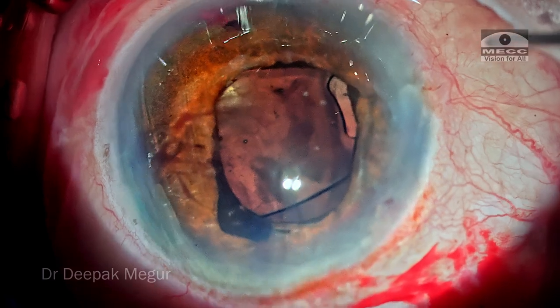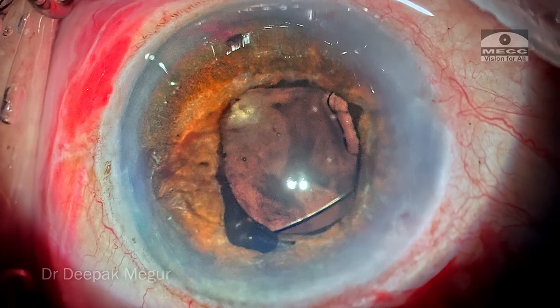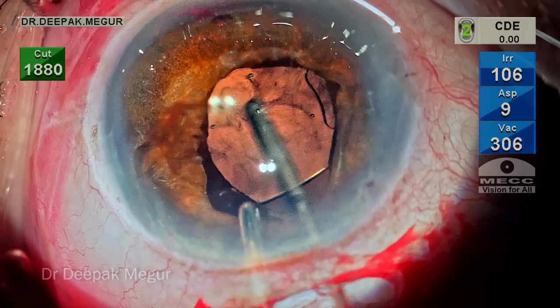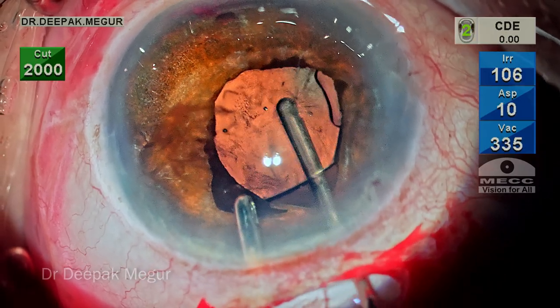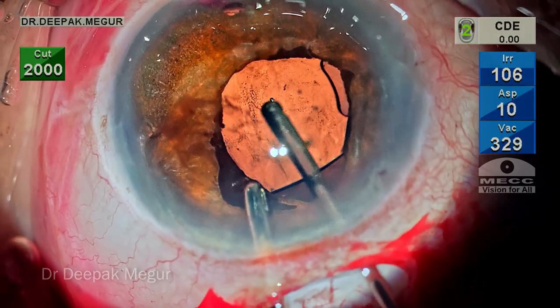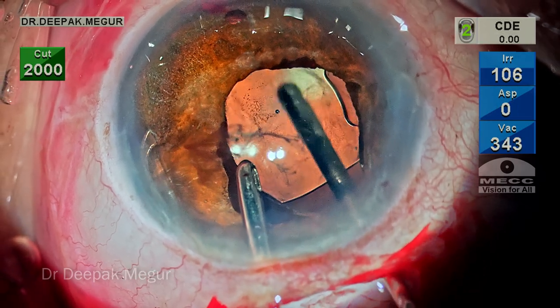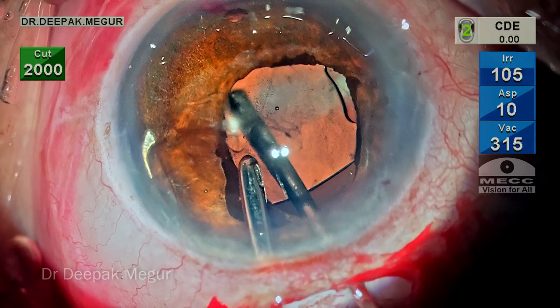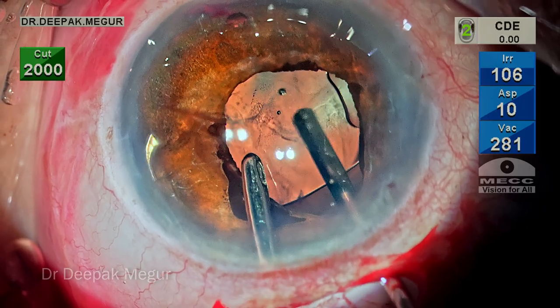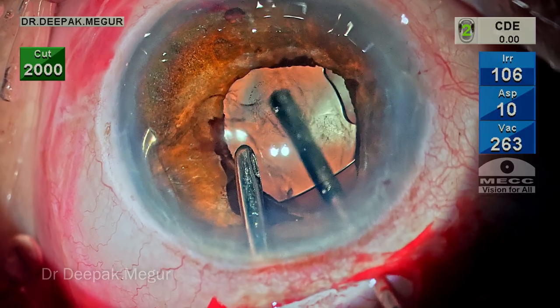The lens looks quite well stable. The pupil is slightly eccentric but eventually it should settle down. Time to remove the OVD and the muck which is there behind the lens. In these cases, I typically use the main incision itself to introduce both the cutter as well as the irrigation cannula, because the eye would be soft and it would be quite a challenge to introduce the irrigation cannula through the very narrow side port incisions. All the muck behind the lens — vitreous, OVD, and some blood which would have seeped in — is all cut and aspirated out.